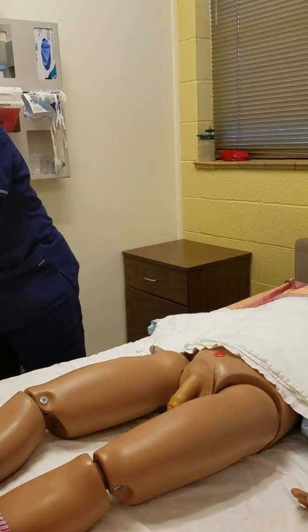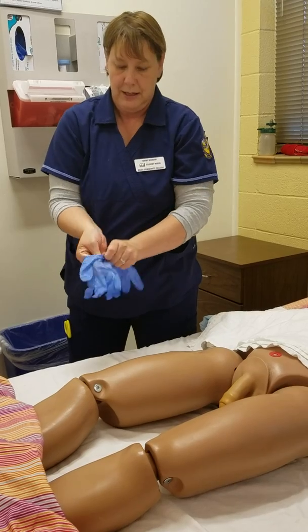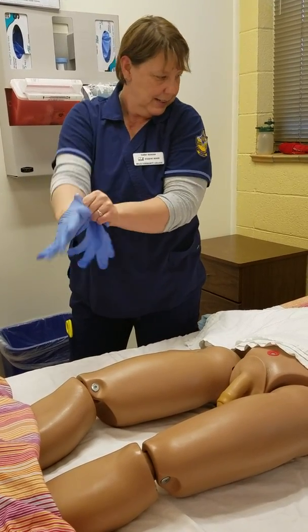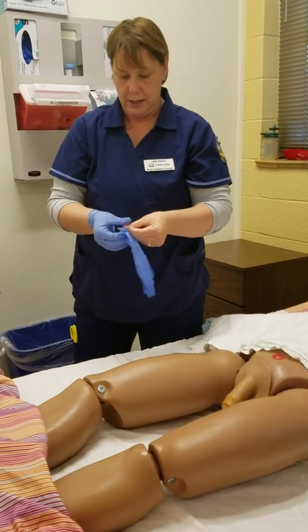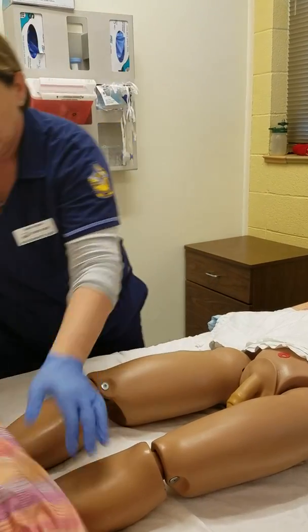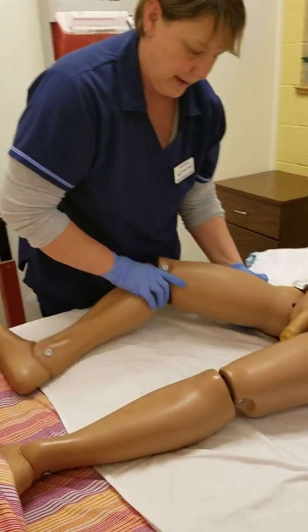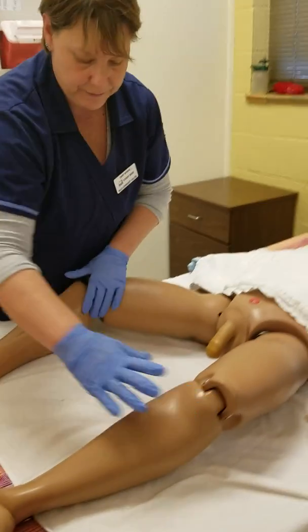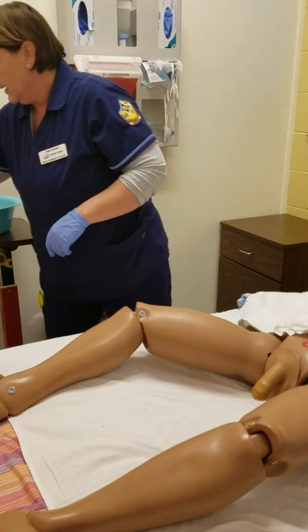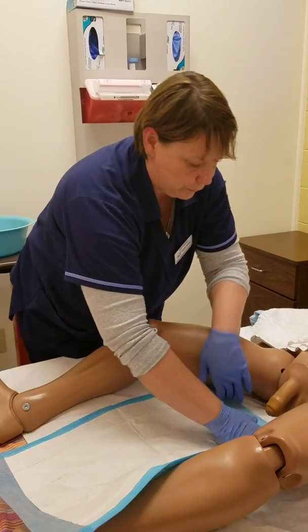I'm going to wash my hands and put my gloves on, which is always a little tricky with wet hands. Once I have that done, I'm going to have him move his legs out to the side — just a little bit. If he's unable to do so by himself I'll do that for him. I'm also going to lay down a waterproof pad here.